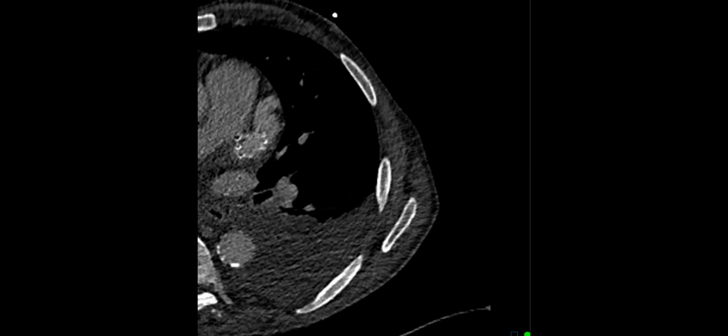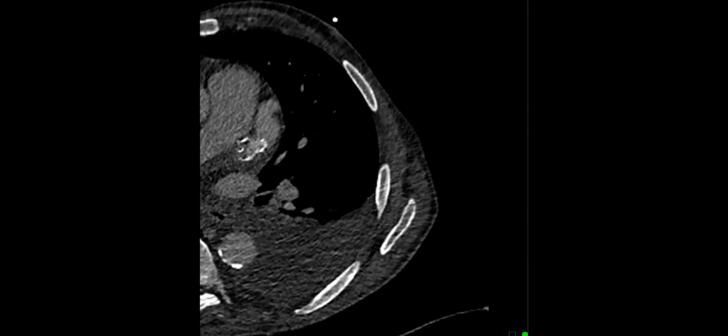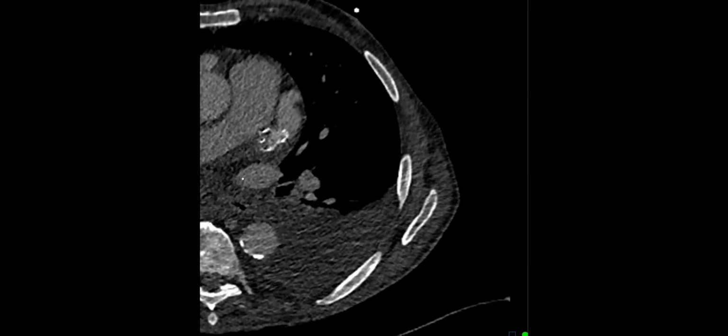Is it typical for TAVR studies to get a delayed phase? At least in ours, we get delayed. Is it because you want to clear the appendages? That's a tough question. I don't know exactly. There are a few reasons. That's obviously one, but it depends on whether your cardiologists really want to know on the TAVR study. There's also research at some centers doing extracellular volume calculations on TAVR examinations to measure how well the patients do afterwards. So there are a few reasons, but as far as I'm aware, it's not standard practice to get a delay on a TAVR.